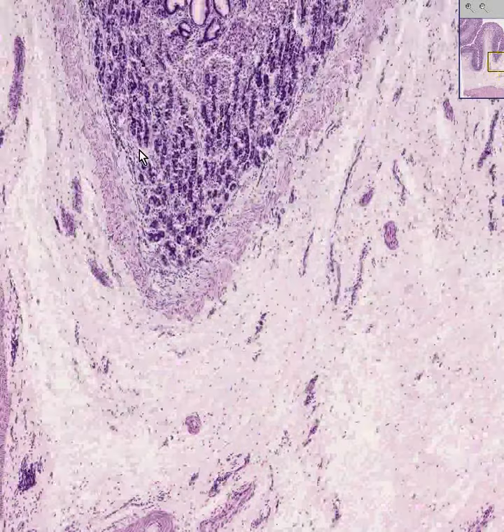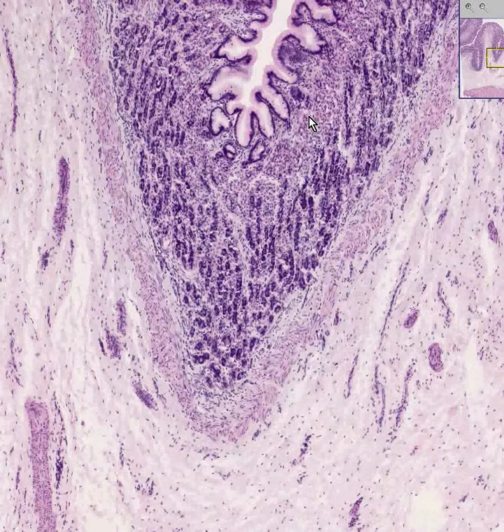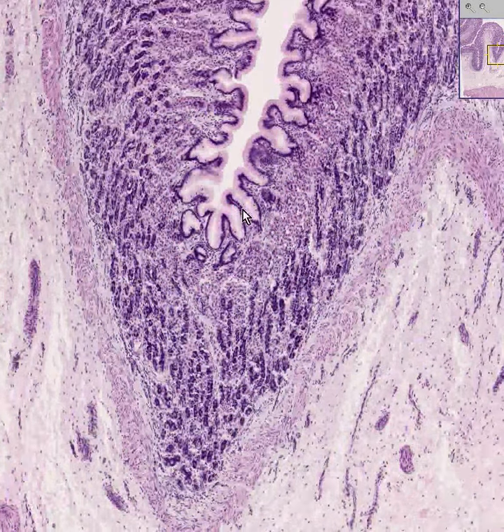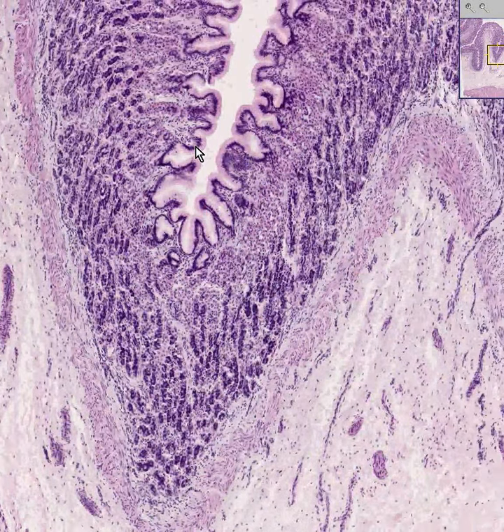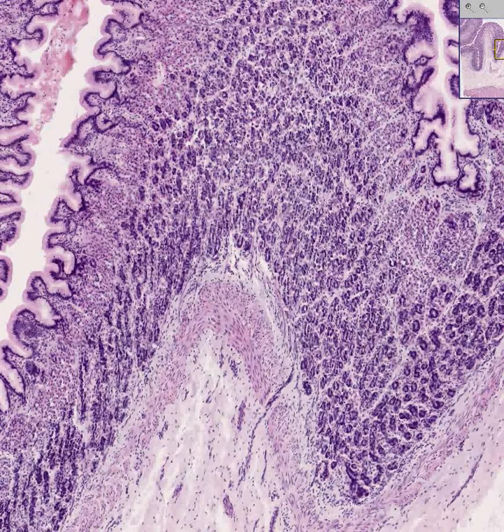Here's the mucosa. Here's the muscularis mucosa. Here are the more orange parietal cells. Here's the darker chief cells. And here is the surface mucous epithelium. And I know that this was shotgun properly. You couldn't possibly miss a thing on this. So let's move on, and I thank you very much.